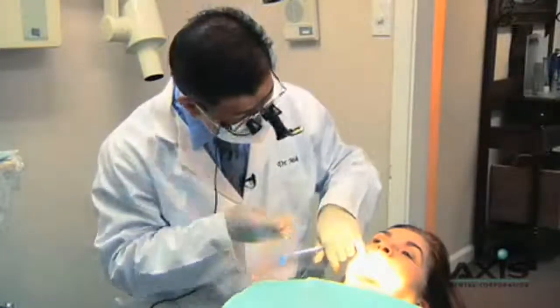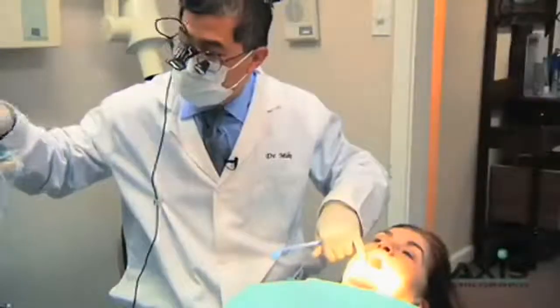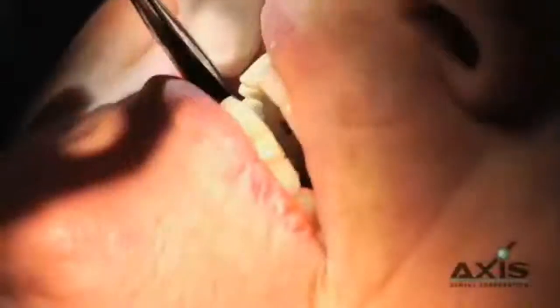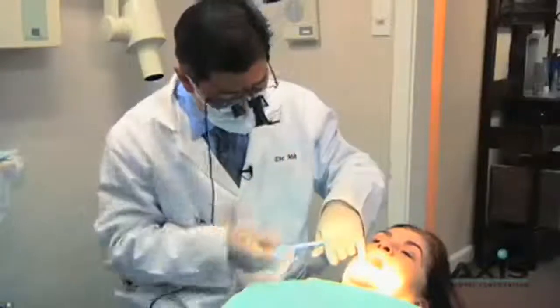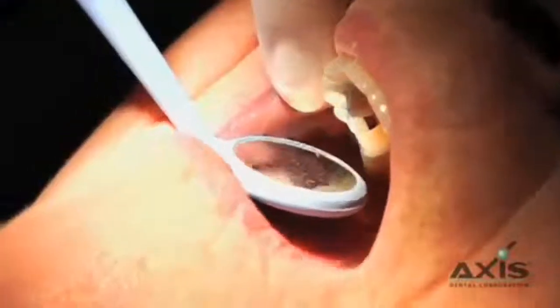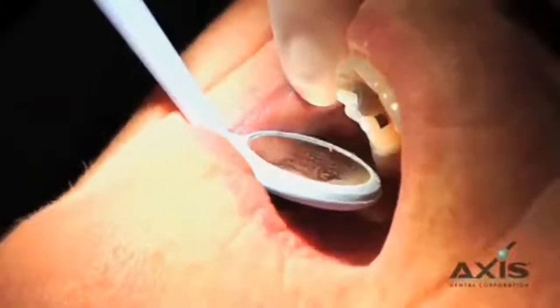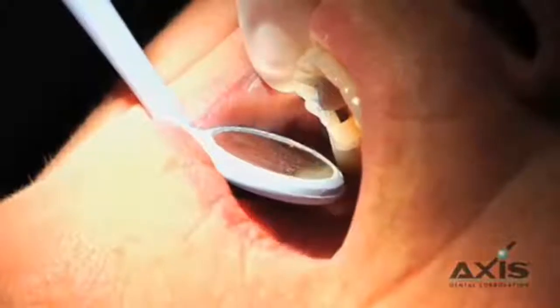So let's start with just drying the teeth off, top and bottom. We'll take some articulating paper and just do tap-taps. Jan was telling me she was hitting a little bit hard on that tooth. So we are hitting a little bit hard on the mesial marginal ridge of three and on the distal buccal cusp.